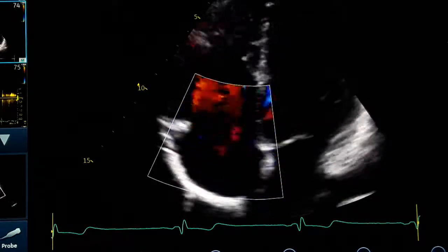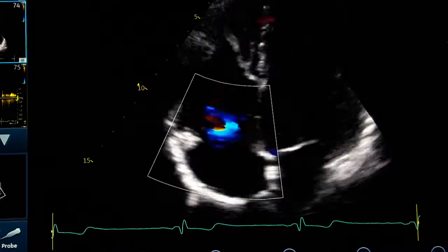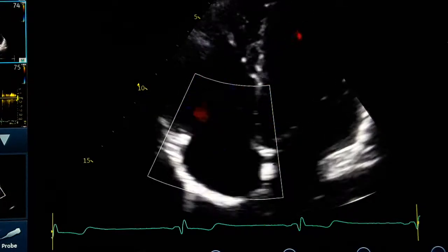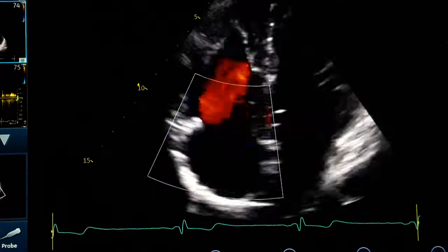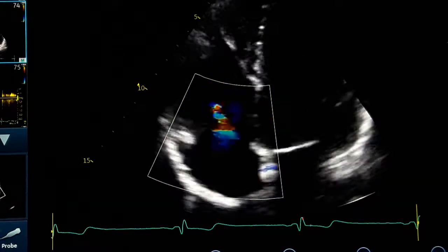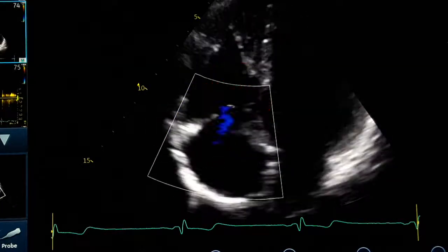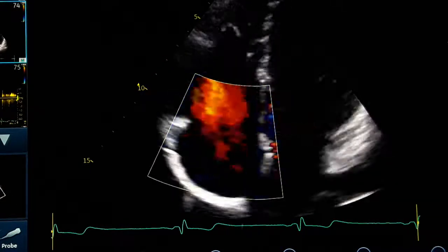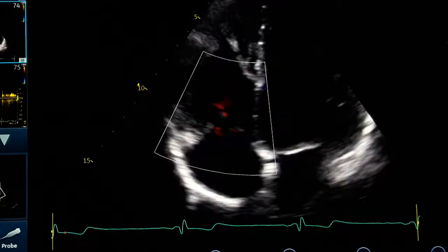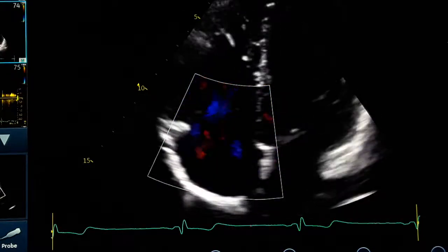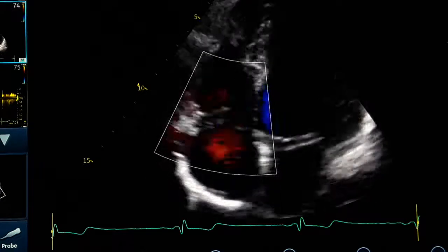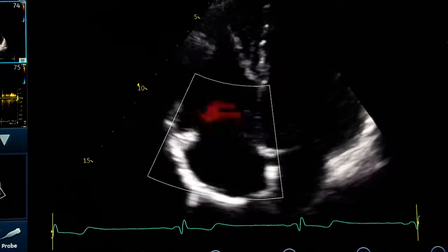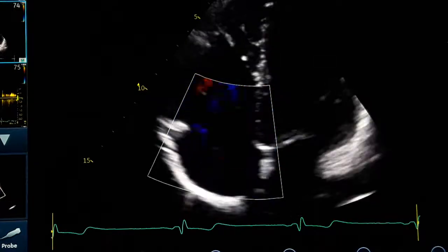Being a little off-axis doesn't matter, because we don't care about left or right ventricular foreshortening here. The most important thing is to detect the jet and make it parallel to the cursor for Doppler measurement. As a general rule, I recommend that beside the standard apical four-chamber view, you always also get an off-axis view by moving to the midline, a little higher than usual.